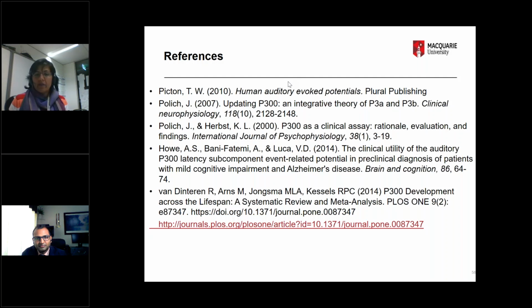Again, you're not diagnosing, but as part of the test battery, you can start to see, well, can they differentiate between these sounds? Do they have that capacity? Yes. And I'm glad you said that, because that was exactly what was in my mind.